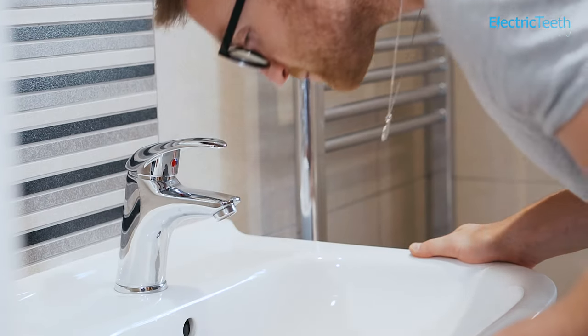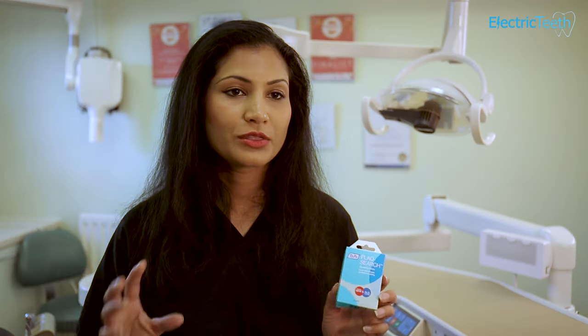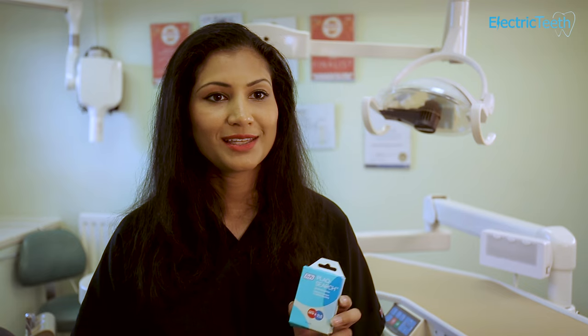You then spit it out and check your teeth in the mirror, and you'll be able to see the areas that have coloured with the plaque disclosing tablets to show you areas that you're missing when you're brushing your teeth.